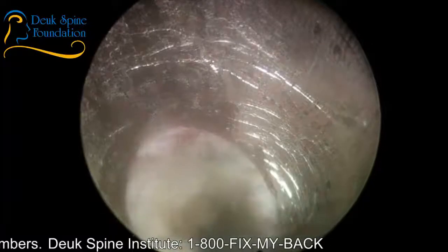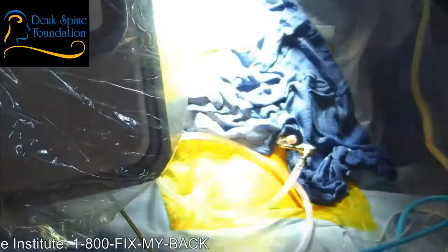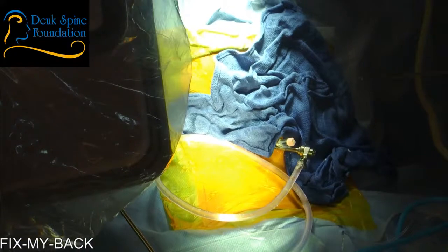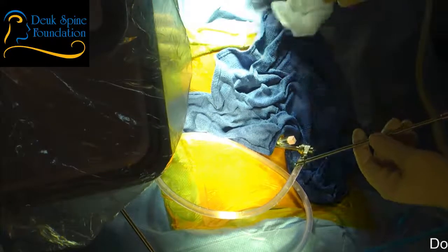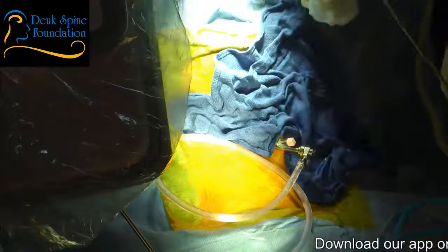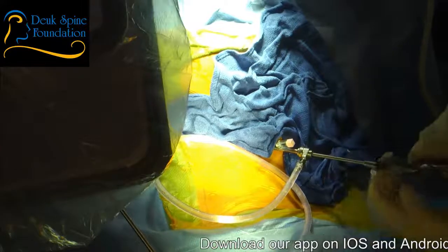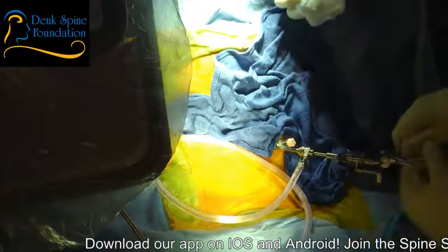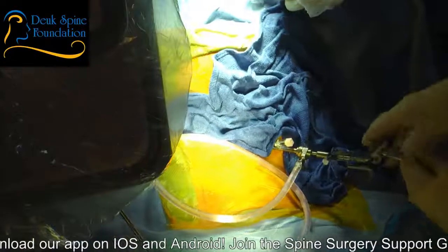Let's have the Grabzilla. For those of you wondering why we call it the Grabzilla, and whether or not there's any relationship to, yes, our favorite monster of all times, Godzilla, the answer is yes, there is a relationship. The Grabzilla is big and beefy. It's designed for one purpose, to do exactly what I'm doing right now, to go in and try to take the herniation out. And it's got a beautiful mouth to do it.